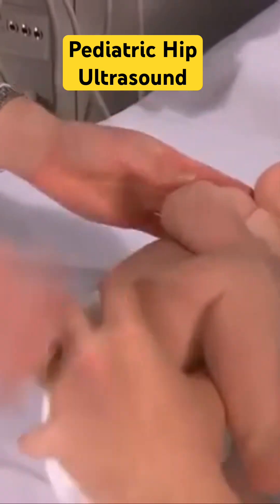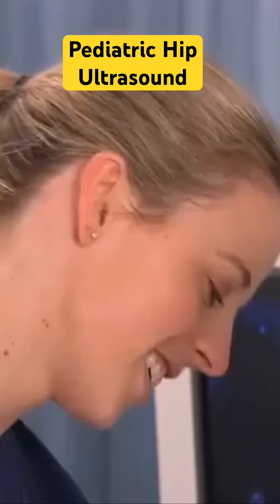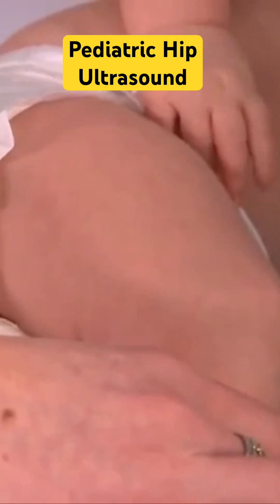Place the patient in the left lateral decubitus position and ask the guardian to hold the infant in this position. Extend the patient's hip with the knee slightly bent.